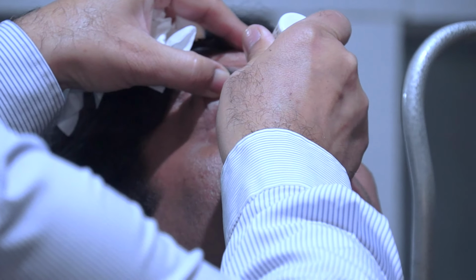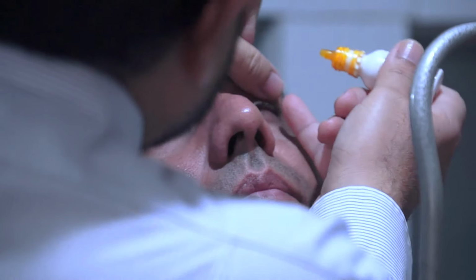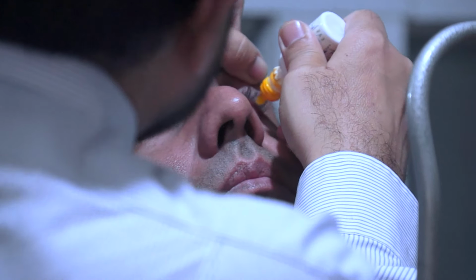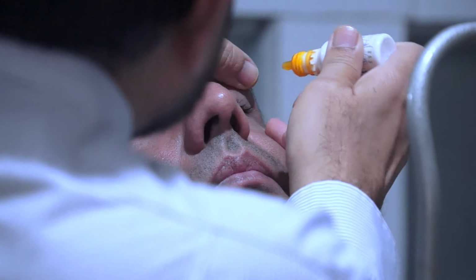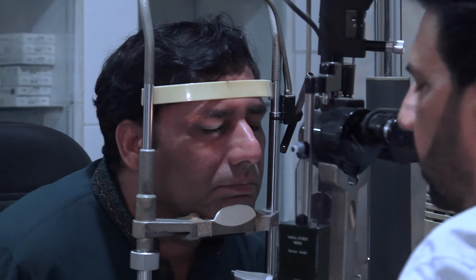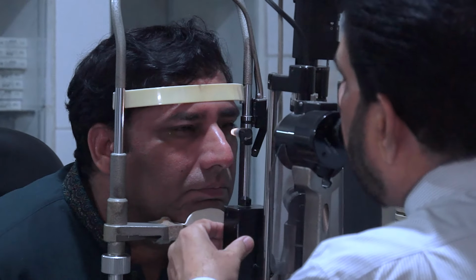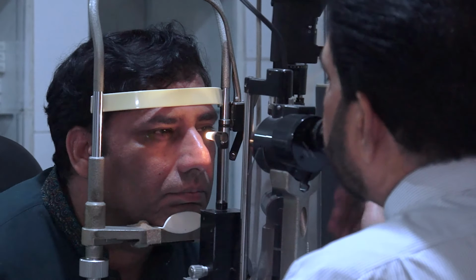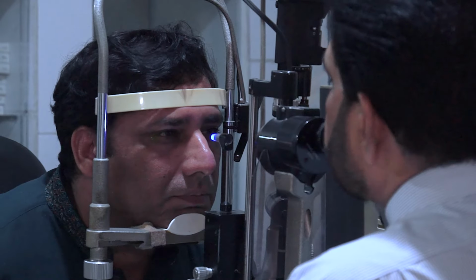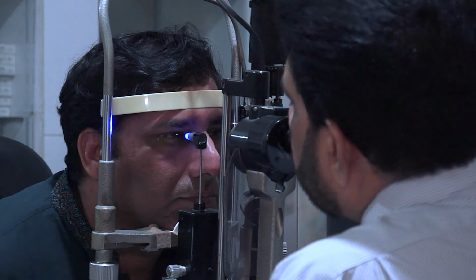Sometimes we mix the fluorescein with the alkaine, or we can use alkaine and separately the fluorescein strips for staining the tear film. After we have stained with the fluorescein, we use the cobalt filter with a full illumination and a full width of the illumination system. This is the blue cobalt filter which we use for this.